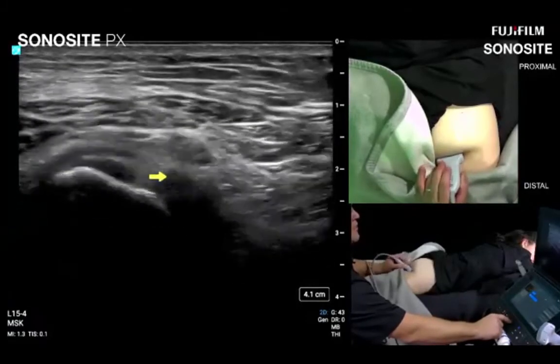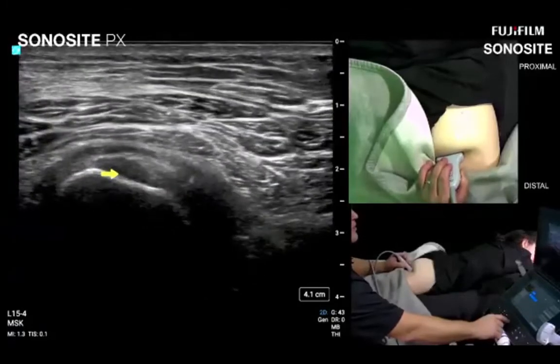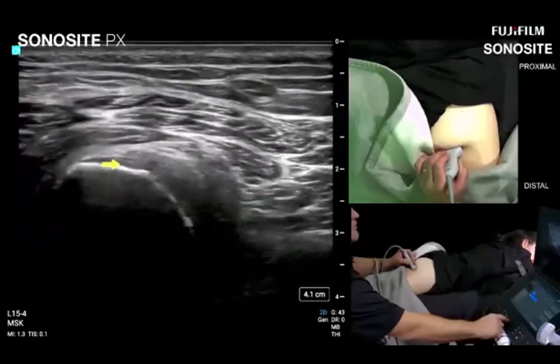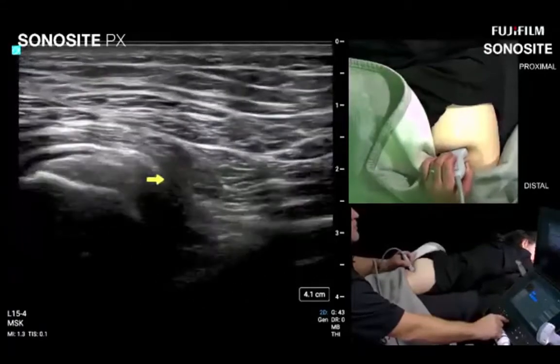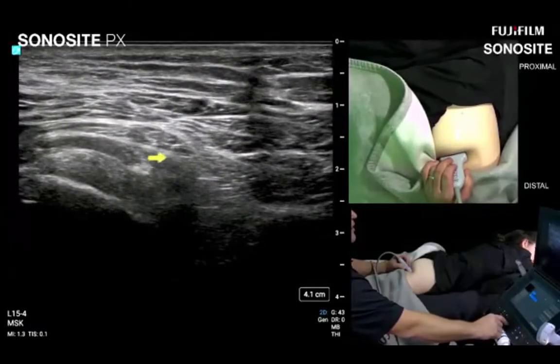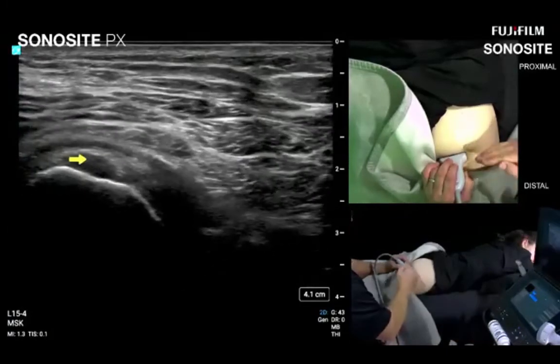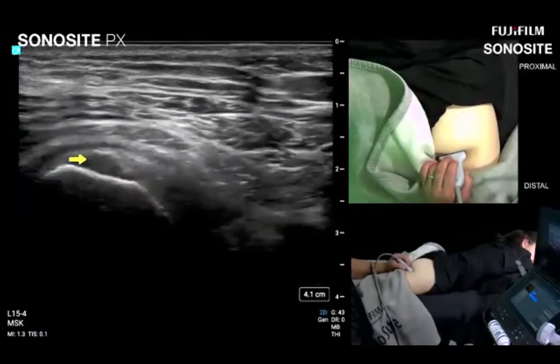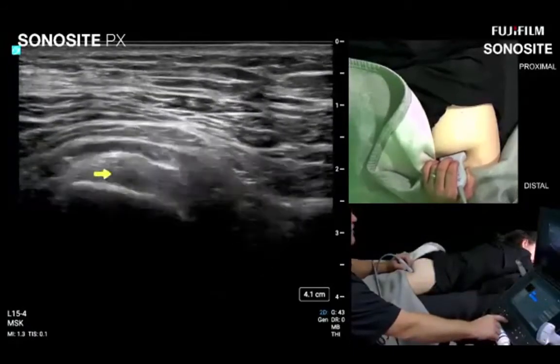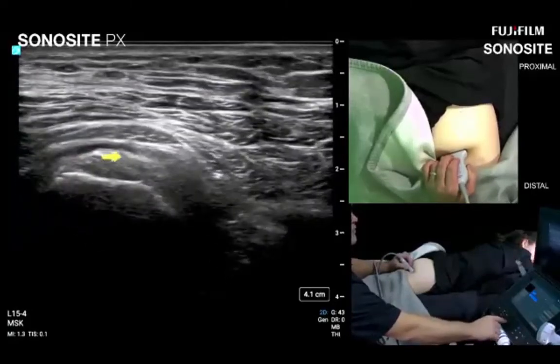Using anisotropy to advantage, the more superior tendon appearing medially is the semimembranosus with its little cleft edge. Watching it join up with the semitendinosus and then the biceps femoris laterally, you can see all three in a row, even though there is a conjoined component. Rocking the transducer very slightly — similar to the biceps tendon in its groove — reveals subtle differentiation. Be careful not to call the anisotropic dropout tendinosis — if you can get the structure to fill in, it is not pathology. Anisotropy is helpful here but can be very misleading.